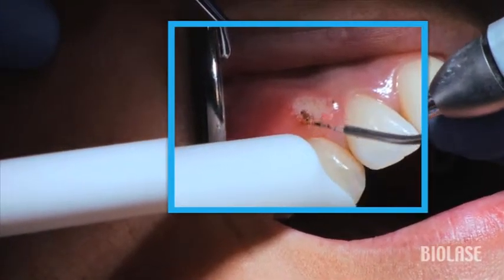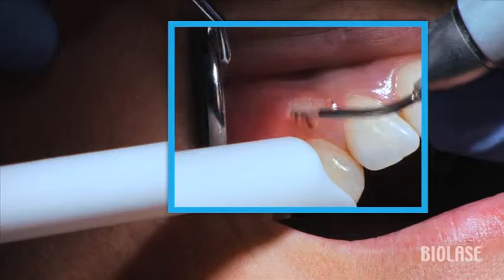This is an easy procedure for the iLase, similar to treating a patient with gingival hyperplasia.